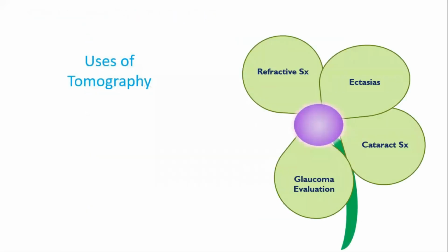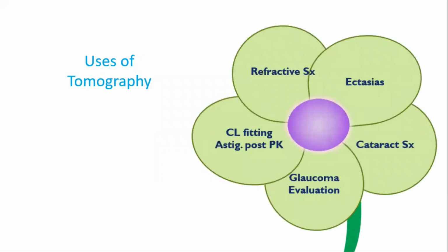So, the uses of Pentacam or tomography as such is for planning and pre-op and post-op assessment of refractive surgery patients, and to diagnose ectasias, and also cataract surgery.